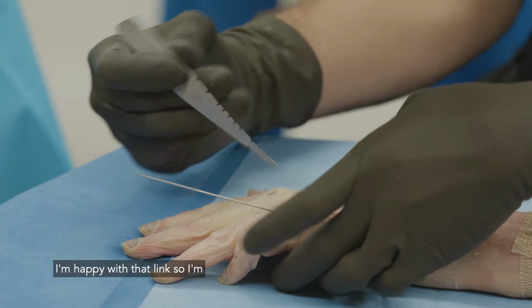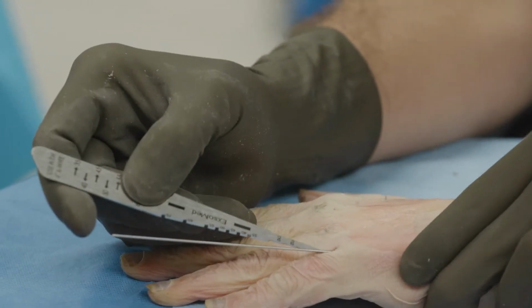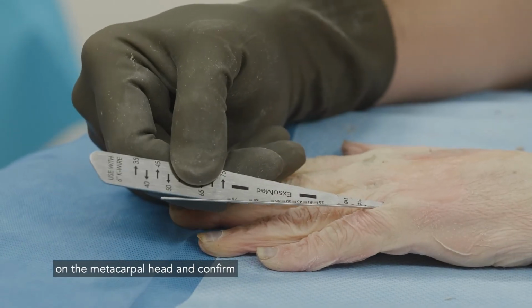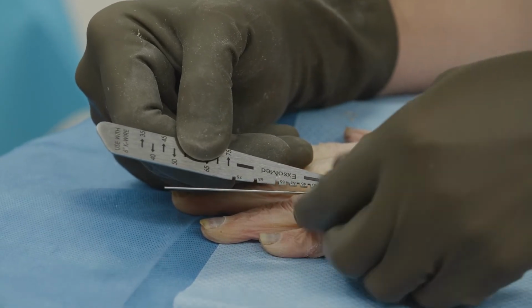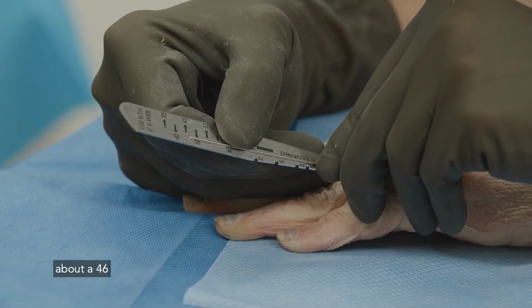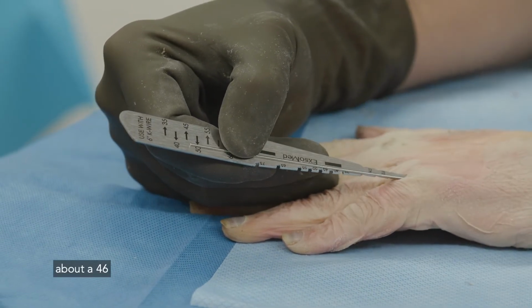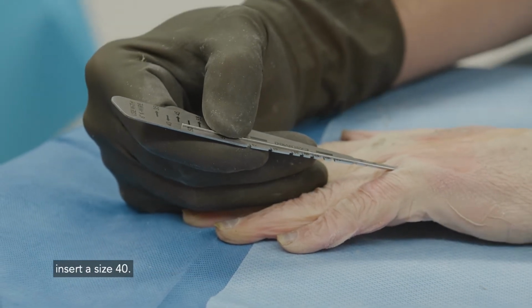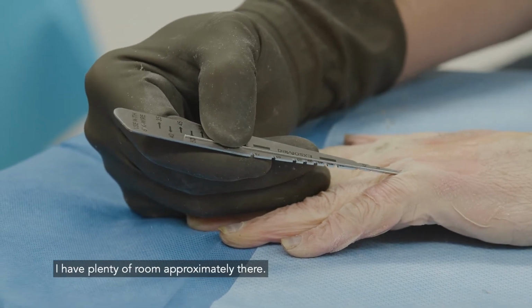I'm happy with that length, so I'm going to go ahead and take my measurement, place the guide on the metacarpal head and confirm the position on C-arm. This is measuring a size 40, about a 46. This is a distal third fracture, so I will insert a size 40. I have plenty of room approximately there.